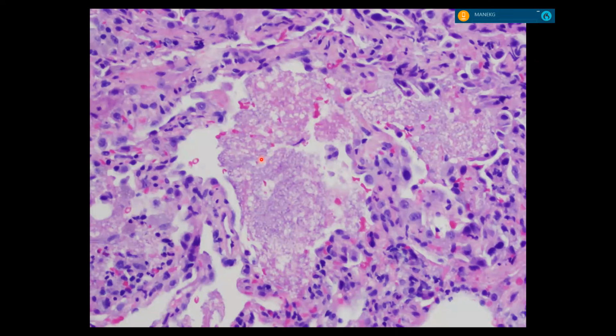Stain, H and E. All right. I won't give you a stem till you give me some kind of guess. Lymphocytic infiltration. Okay, I'll give you a 65-year-old man. Let's do a 42-year-old man with a very low CD4 count, with HIV/AIDS. And I've given you already a why? You just said lymphocytic infiltrate, which you're right actually.